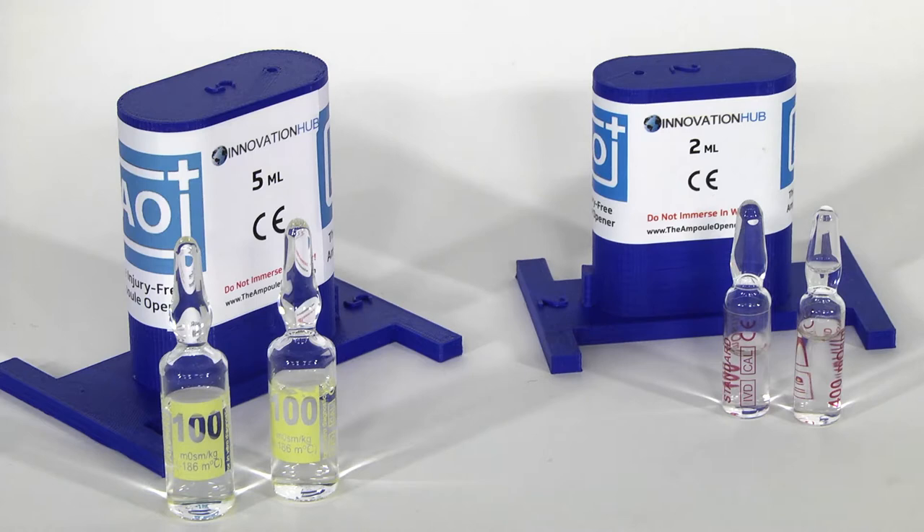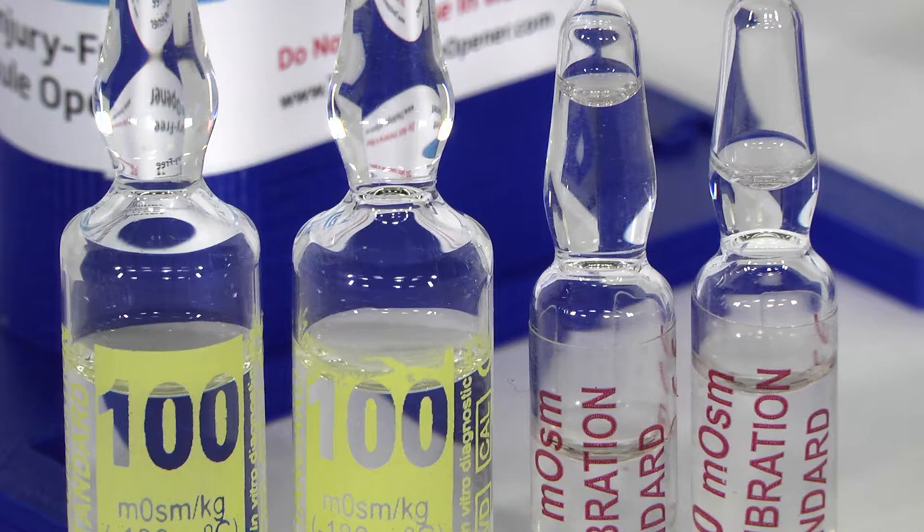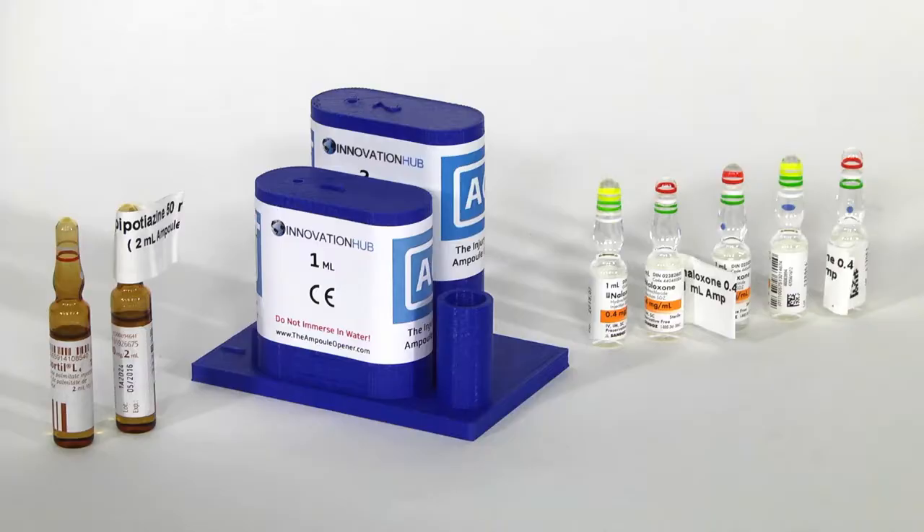This is a 2mm and a 5mm unit for advanced instruments reagent ampules. This is a unit encompassing both a 1mm and a 2mm opener on the very same base. This was manufactured for CAMH in Toronto, a drug rehabilitation hospital.